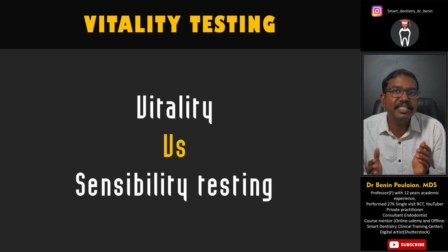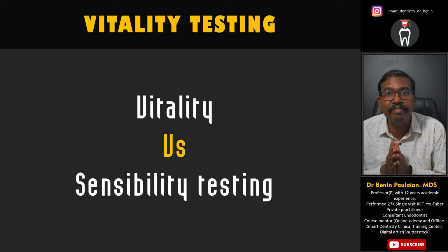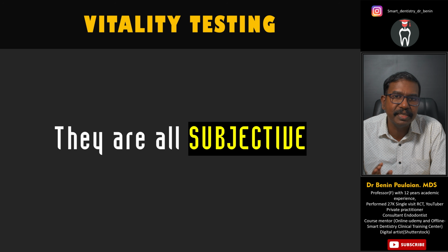Unfortunately, both of these techniques have not yet developed to an extent that the devices are available for diagnosis in clinical practice. So, whenever we call a pulp diagnostic test a vitality testing, it is not a true vitality testing because we are not using it.